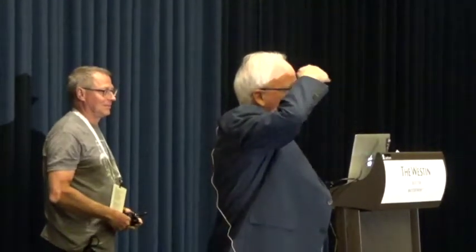I just had a question. Since you're not taking any new CBCTs to read, do you have any reference where to seek a radiologist that would read for these types of things? Until we take the class. Who can I send them to? Is that what you're telling me? Yeah. I think just about anybody in our particular discipline, including me. I still take on patients and clients, don't worry.